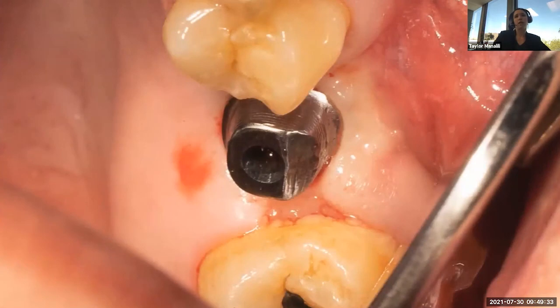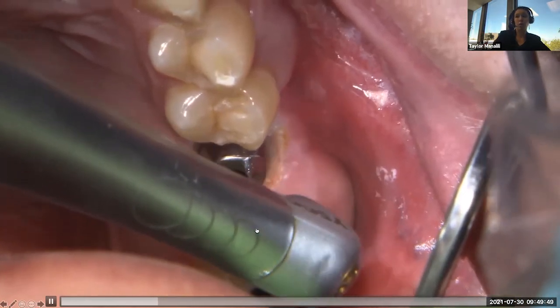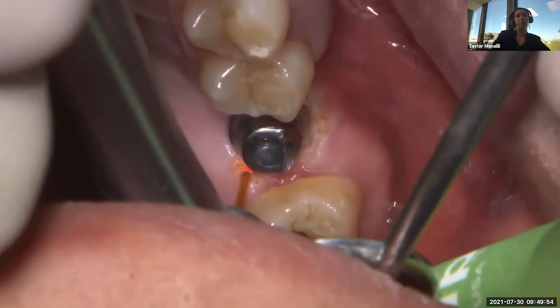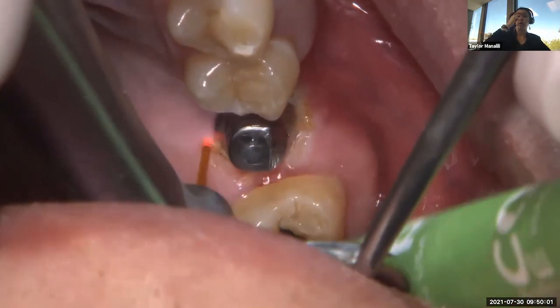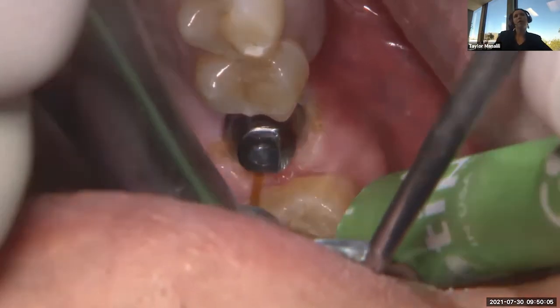In this one, he had a custom abutment that was inserted. What you see here is that part of the margins are subgingival, right? So he has to expose these margins. You have a couple ways of doing this. The first way is you can pack cord like you would around a tooth prep. The other way is using a laser, which he's showing here. In our office, we have a BioLase WaterLase YSGG. It's an all tissue laser that we're utilizing here.